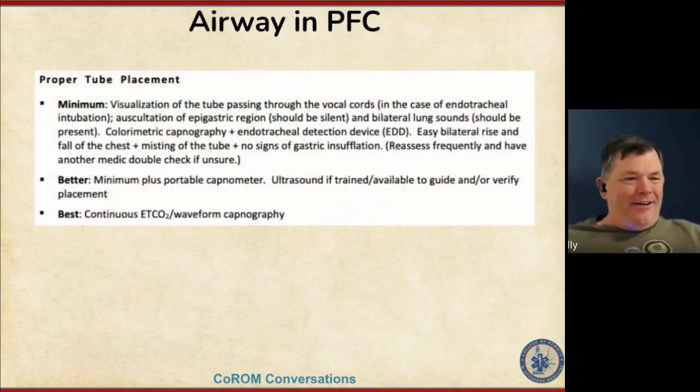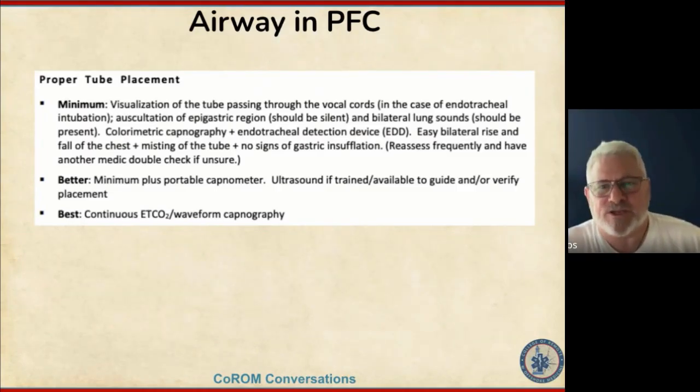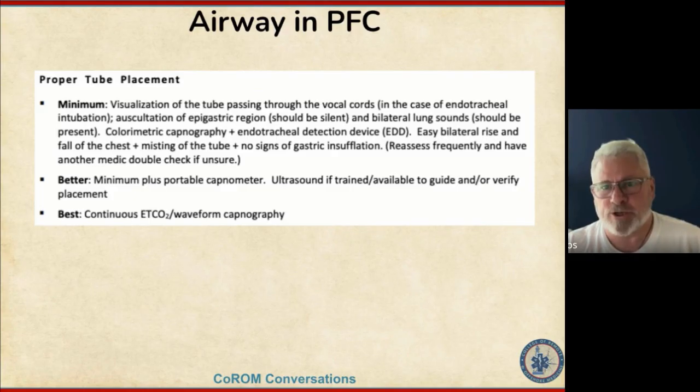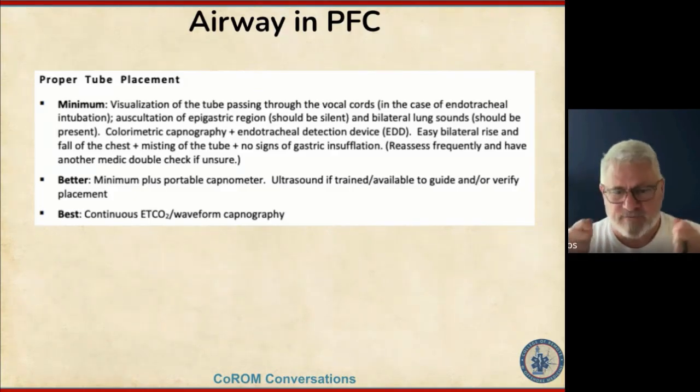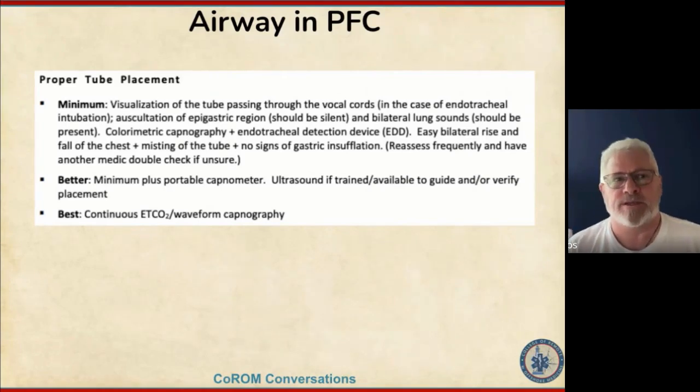All right. Okay. Proper tube placement. What's the thinking here? Well, you just have to make sure that if you're putting a tube in an airway, are you in the airway, and how do you confirm that? Whether you have that colorimetric capnography that you put on the tube, so you start seeing it change color and you're in the trachea, or you just have auscultation. It still amazes me how many times people will listen and they don't listen to the stomach first.